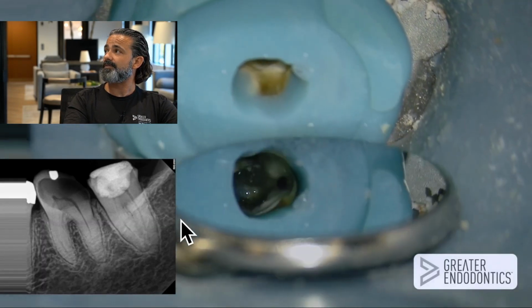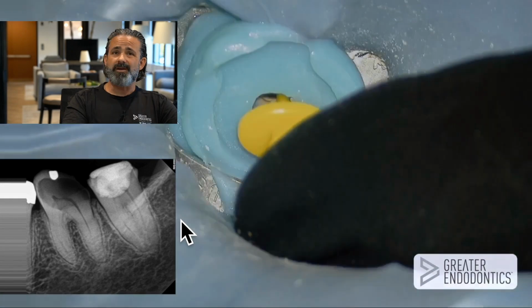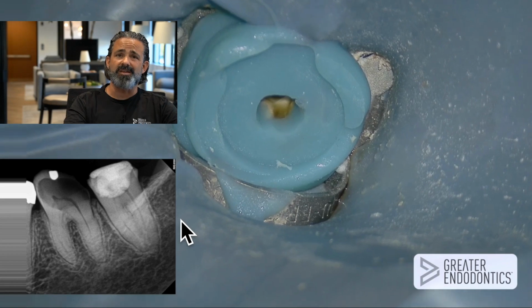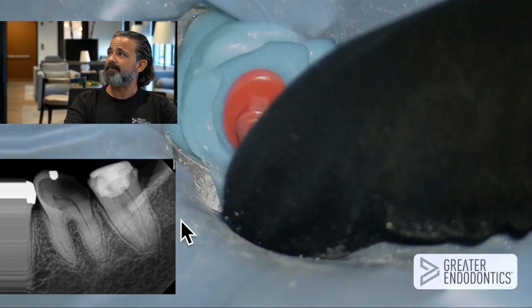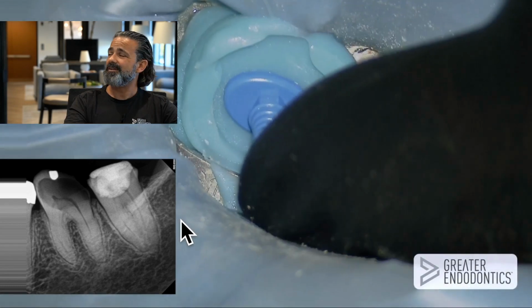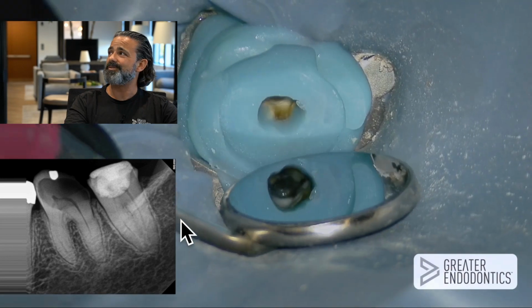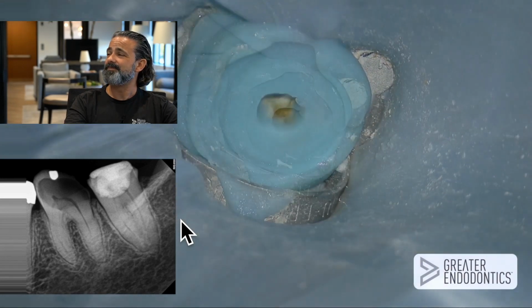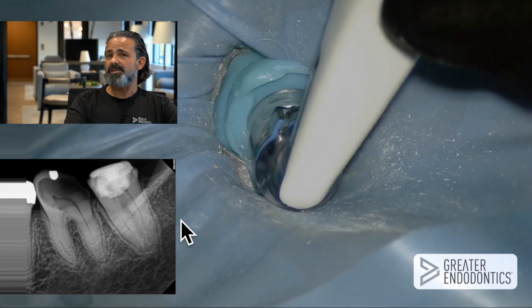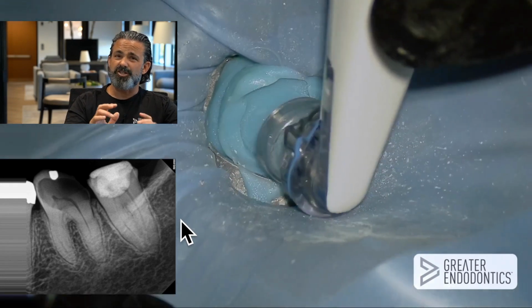All right, let's get this into focus. Okay, now it's time to use the depth gauges, the little depth gauge jigs. It started with a yellow. It's touching the floor. Then went to the 9, or the red. Just flipped my blue out of the mouth, so it's going to give me a new blue. And that was the size I determined. So she put the cap on. Didn't feel the scratchiness along the floor.